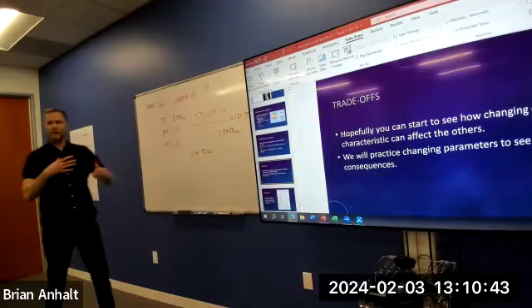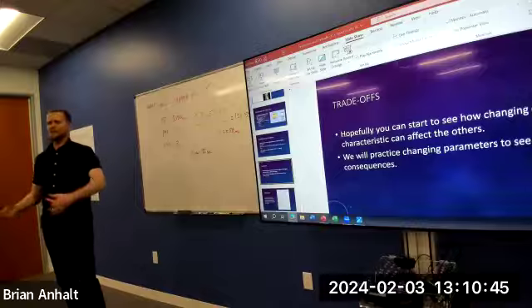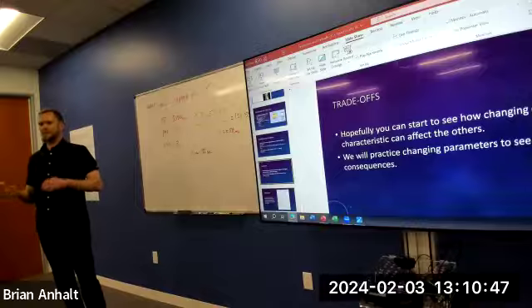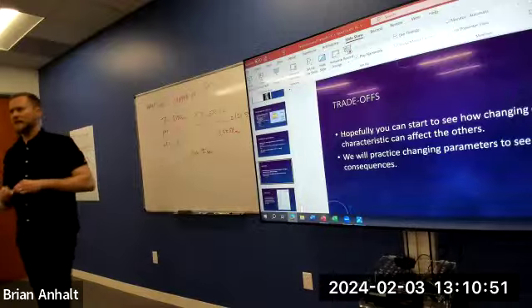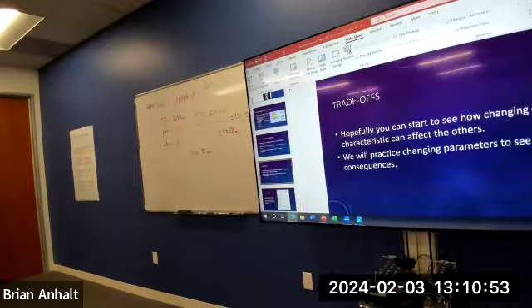But on scanners, there are still spin echo sequences that don't have an echo train length that are used sometimes. And that is your scan time: TR times NEX times phase matrix. Actually, fast spin echo sequences are a semi-new creation, so talk to techs who've been doing it for 20, 25 years. They didn't have fast spin echoes when they first started.